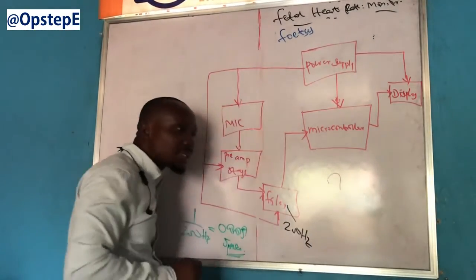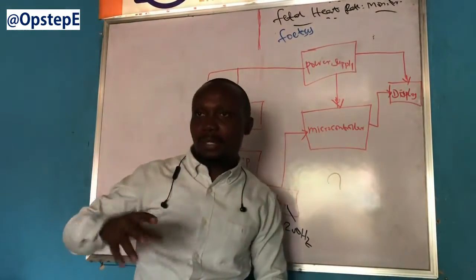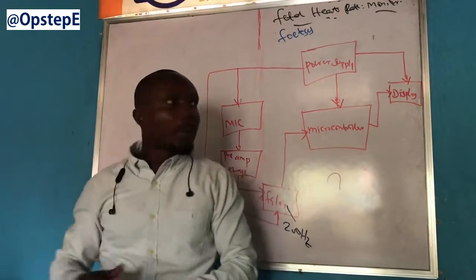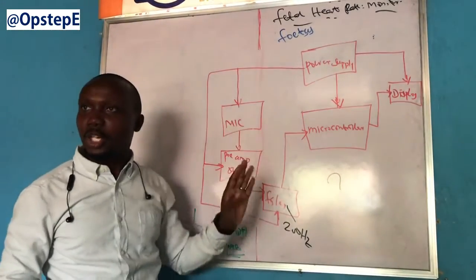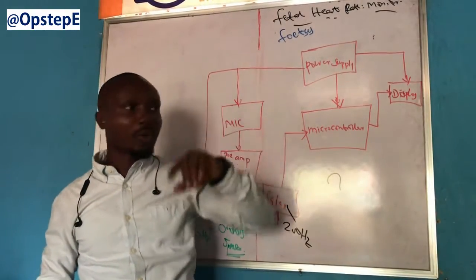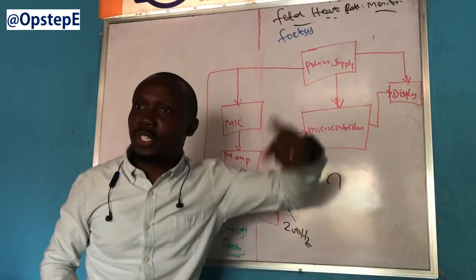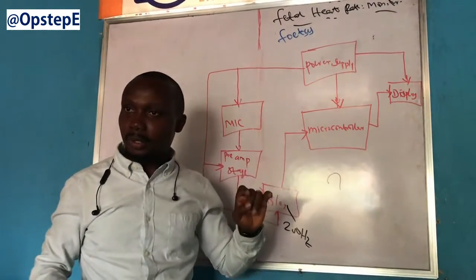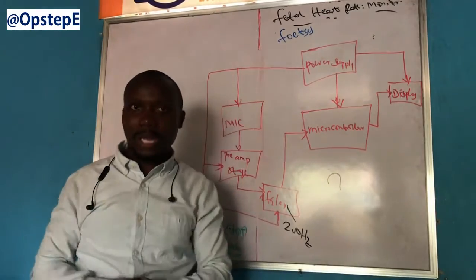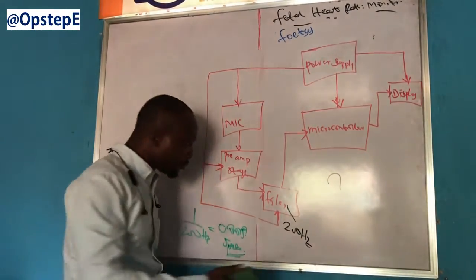So the signals, of course, don't forget, for it to actually even go into the mic, the DC property in my voice has to be blocked by its capacitors already in the preamp stage and the filter stage, so that only the AC property of my sound or my voice or my speech is what is received. How then do we convert that to pulse? It's still something we still need to work on. So I need to say that for the record, so that we're on the same page.